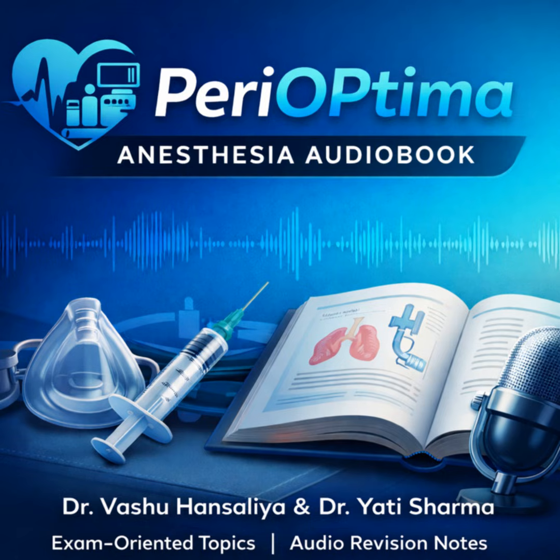Okay, so within those traditional DL devices, the next level of classification is the blade itself, the physical design. Correct. And that design really dictates how you use it. We split them into curved blades, with the Macintosh being the prime example. A smooth, gentle curve from base to tip. Exactly. And then you have the straight blades, like the Miller. Yeah. It has a straight spatula, and it's designed for a totally different, more direct lifting method.